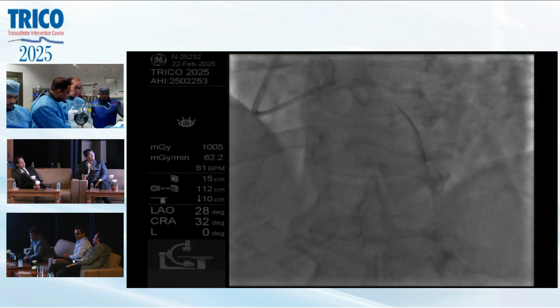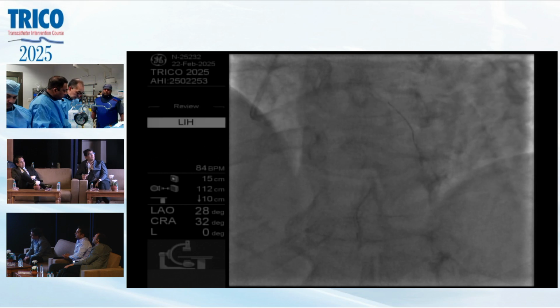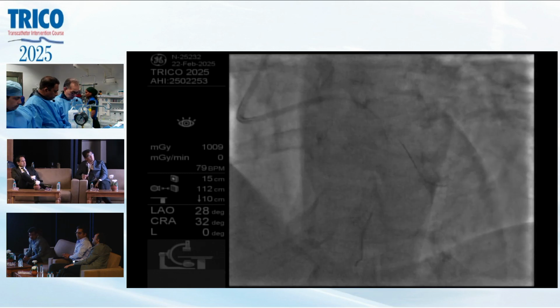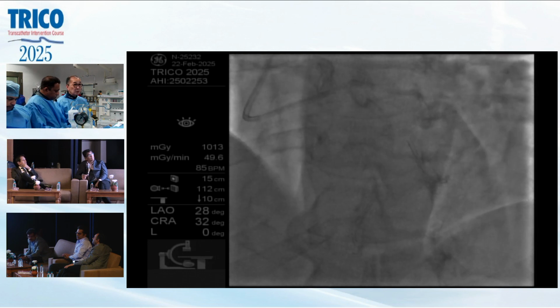Okay, good. You give a nitro? So we can do a picture.